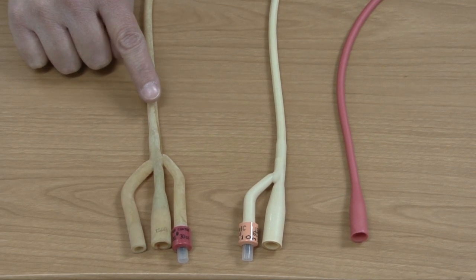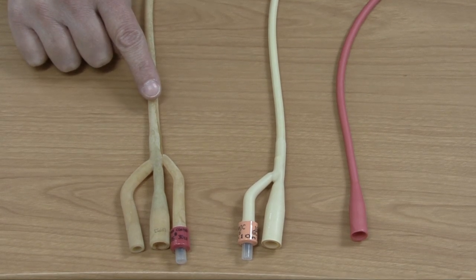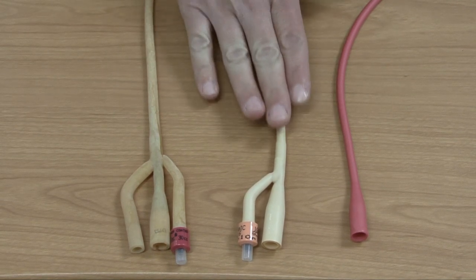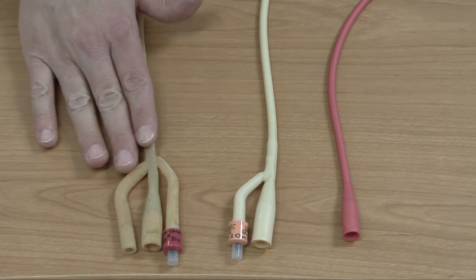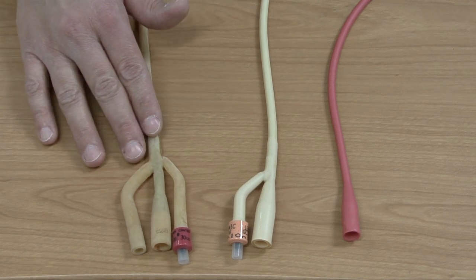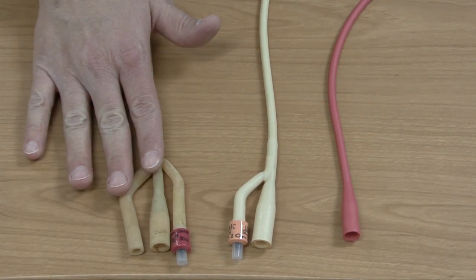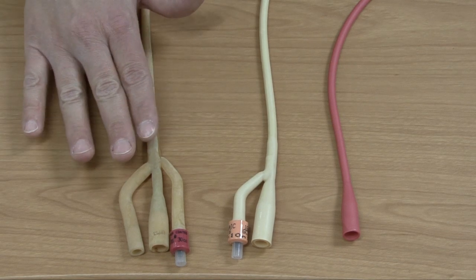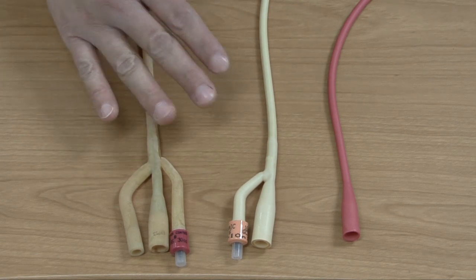It's always important to know what size catheter you need to use on your patient. Normally with children you're probably going to use a 5 French with an infant; an 8 French tends to be with pediatric patients. With adults, 16 French is most commonly used and that's what comes in your kits in most hospitals. Once you get up to three-way catheters, the catheter has to be larger to allow for installation of irrigation fluids — thus the size of 18 French, or you could go up to a 20 or 22 French.